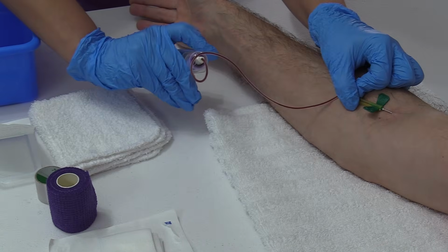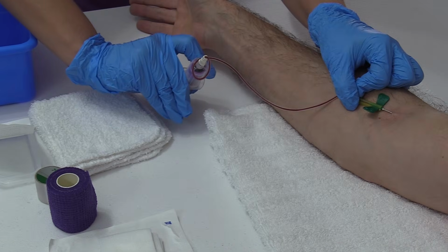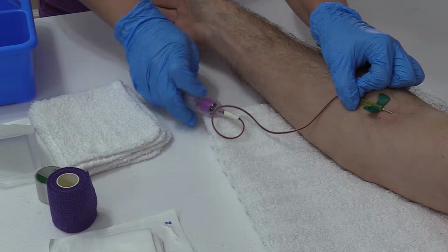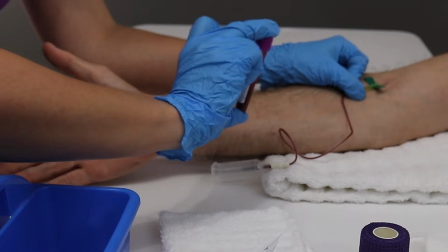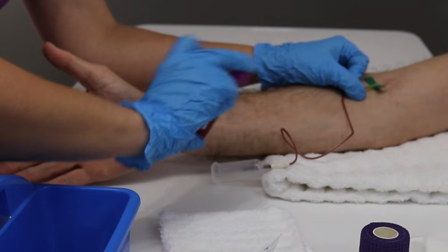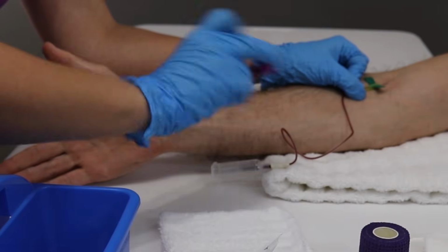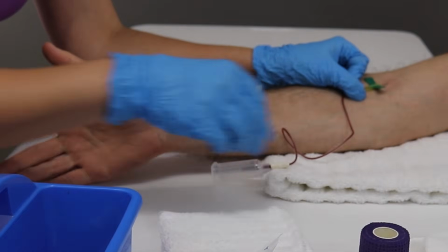Again, letting it fill to the fill line. Okay, that's done. Now I'm going to invert that 8 to 10 times. So 1, 2, 3, 4, 5, 6, 7, 8. Set that aside. Now I'm ready to remove the needle.